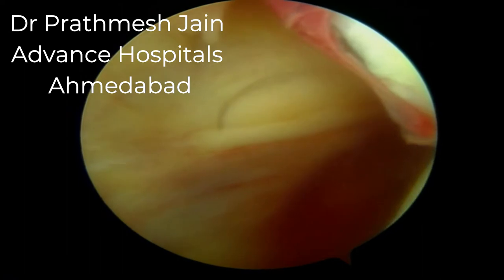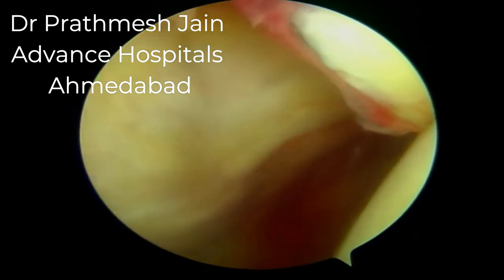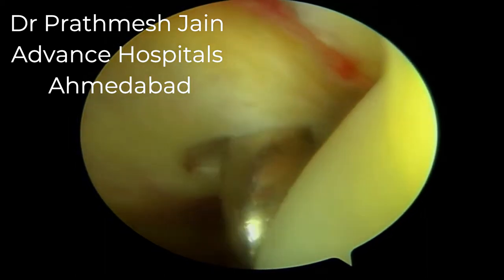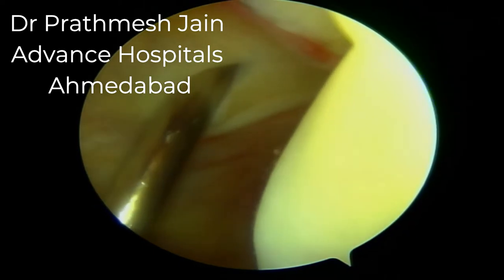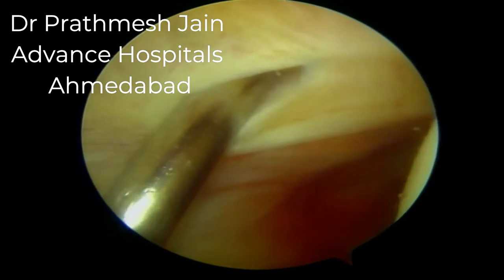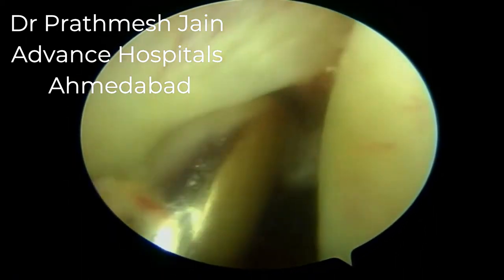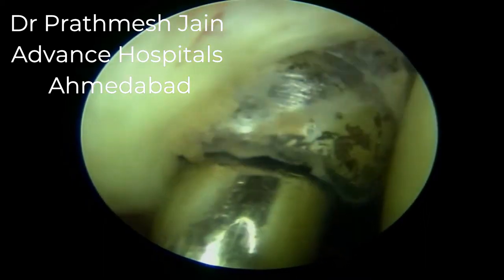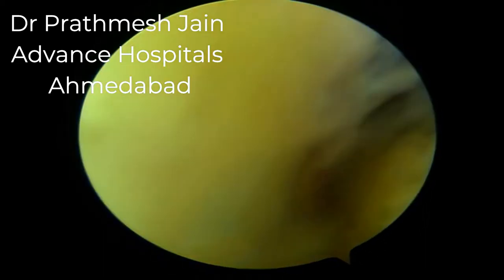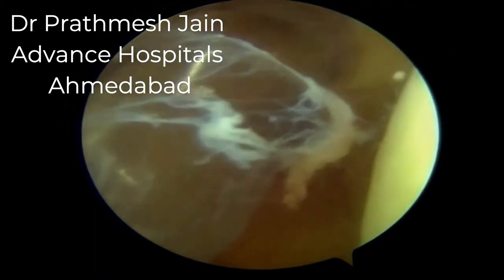From there we will make two portals. The first is a superior posterior medial portal, which will be utilized as the primary viewing portal. We will place two seven-millimeter diameter transparent cannulas on the posterior medial aspect, and the rest of the surgery will be performed under vision from the posterior aspect of the knee.